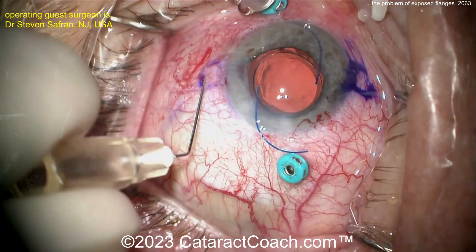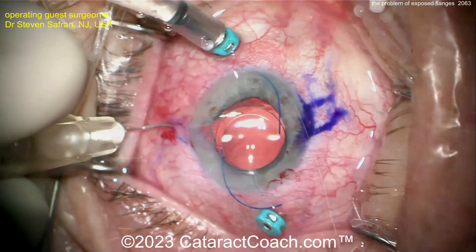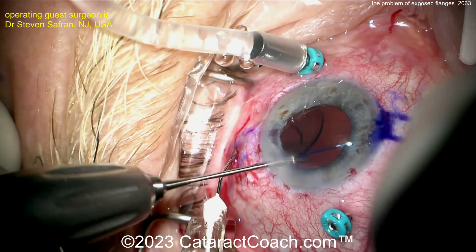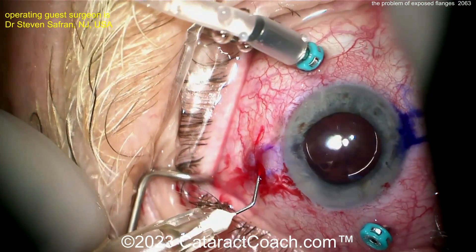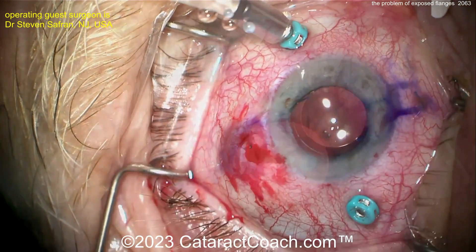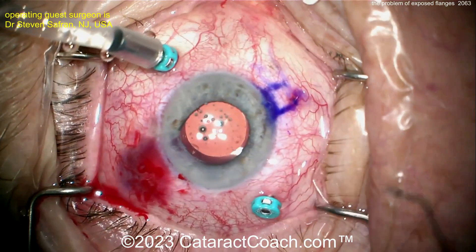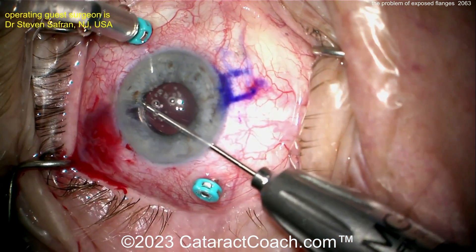Then he's going to do a Yamane intrascleral haptic fixation. Now look at the angle of passing that 30-gauge needle — it creates a scleral tunnel, starting off very tangential to the surface of the sclera, so there's actually a longer scleral tunnel. That's done on both sides. When these haptics are brought out, they are within the sclera for a good amount — at least a few millimeters. The little tiny flange that's created is not left under the conjunctiva; it's pushed within the sclera. Notice you can't see the blue nubbin anymore of that haptic flange.